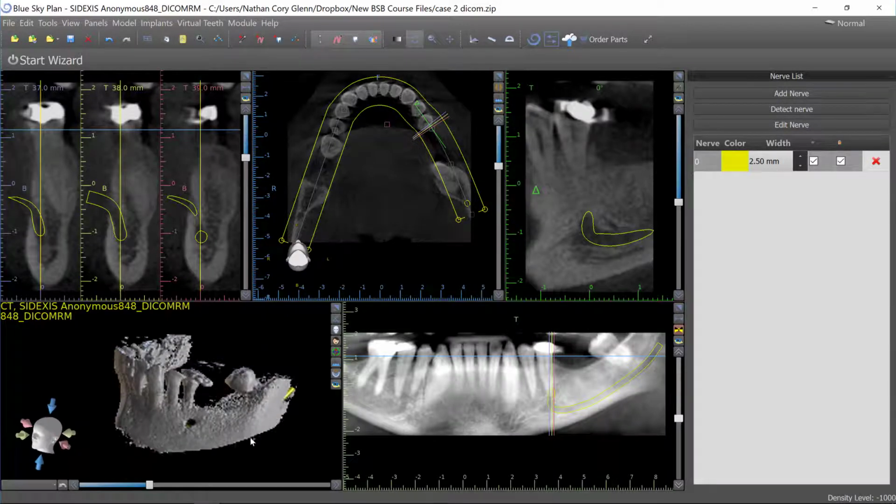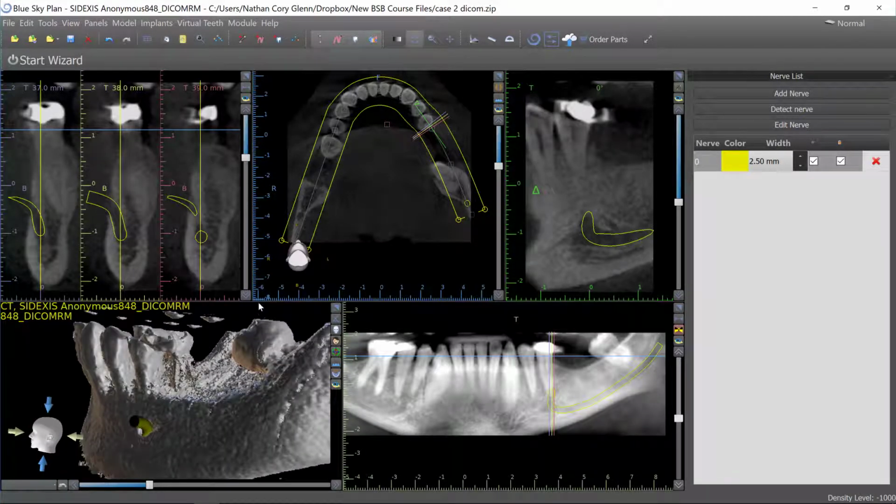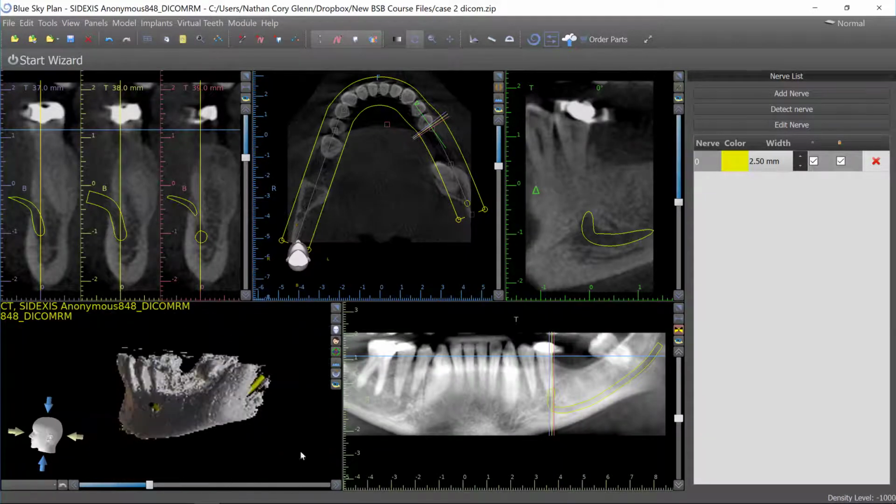And so in this case, what we're going to do is plan on coming in and just maybe removing this half of the tooth so that it's not in the way of placing the implants properly, but maintain this distal portion of the tooth to support the surgical guide. And then once the osteotomies have been made and the implants placed, you could finish out the extraction here. So that is the plan.